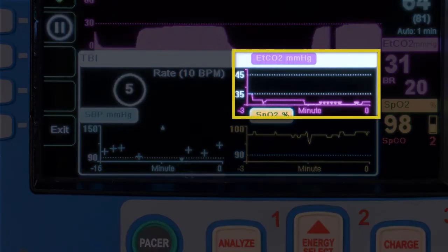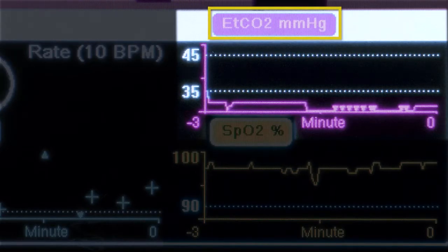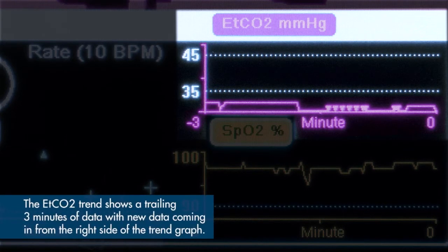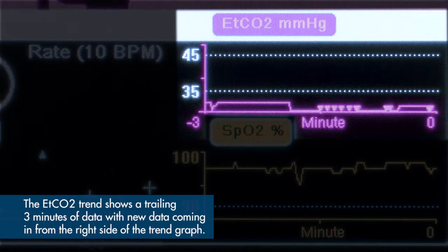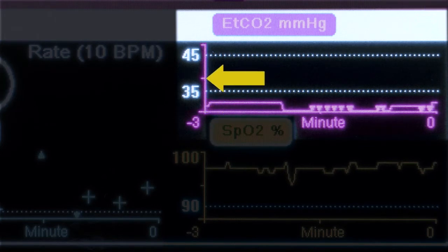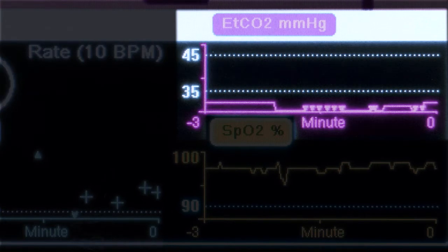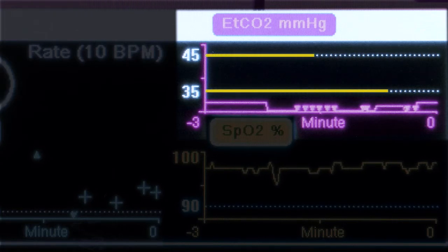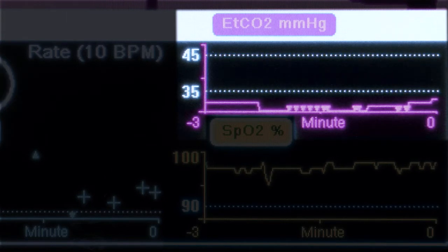Next, we will cover the capnography, or ETCO2, trend. The trend graph shows ETCO2 measured in millimeters of mercury (mmHg) over time. The ETCO2 trend shows a trailing 3 minutes of data, with new data coming in from the right side of the trend graph. The default viewable range is a low of 30 mmHg to a high of 48 mmHg. Data appearing within the viewable range will display as a linear graph. There are also supervisor-configured low and high ETCO2 limits, shown as white dotted lines on the graph. They are only available in the adult patient mode.